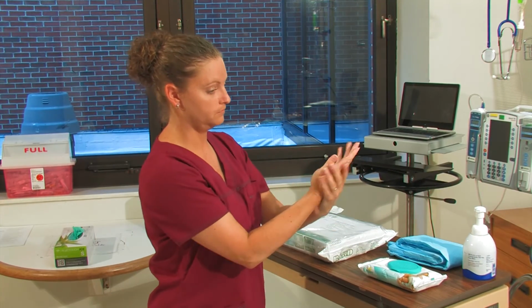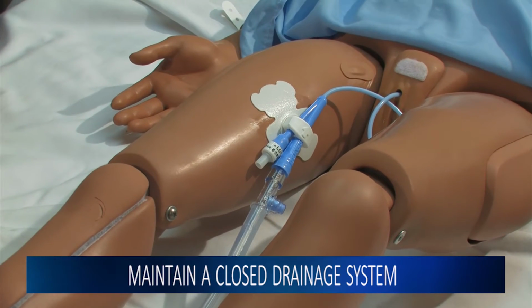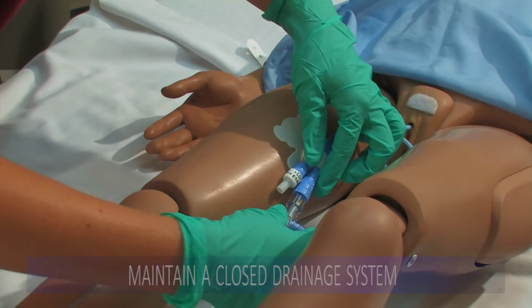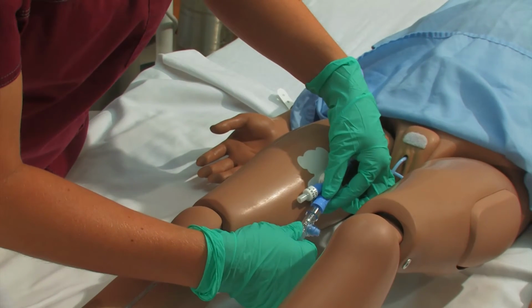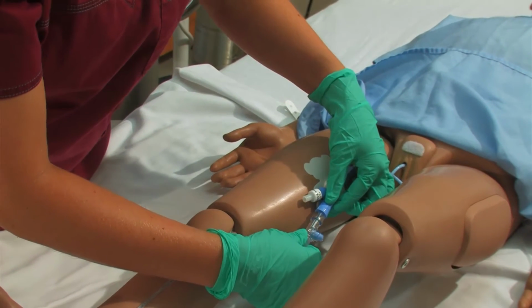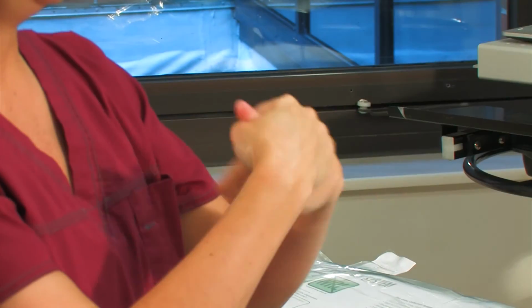Make sure to maintain a closed drainage system. If there are breaks in the aseptic technique or disconnection or leakage, replace the catheter and urine drainage equipment using aseptic technique and sterile equipment. Obtain urine samples from the urine sampling port using the aseptic technique.